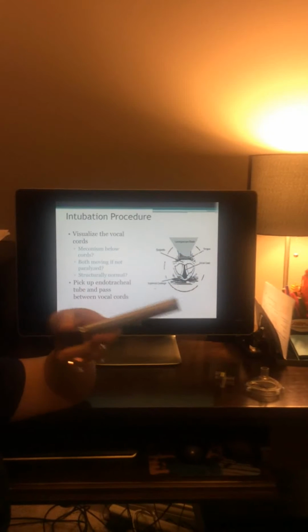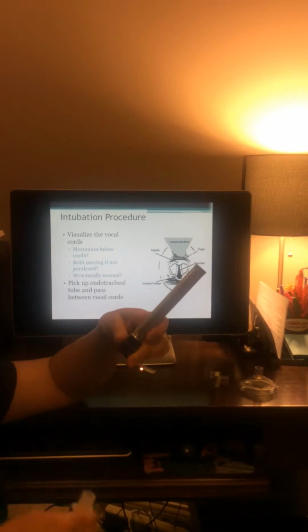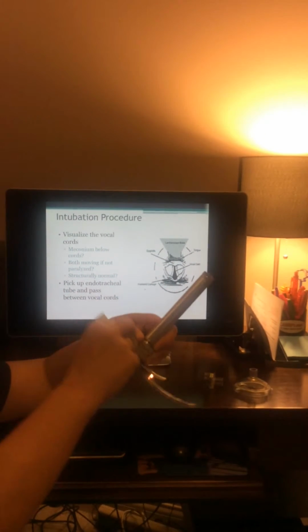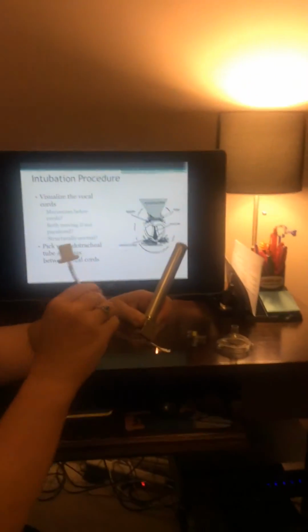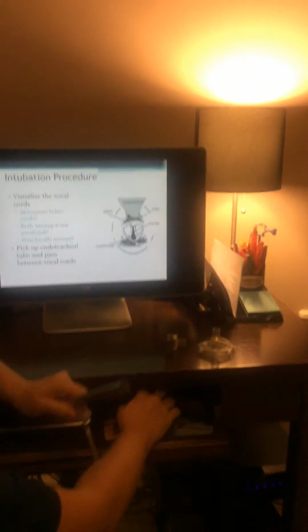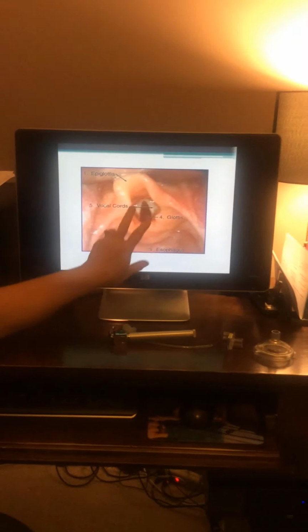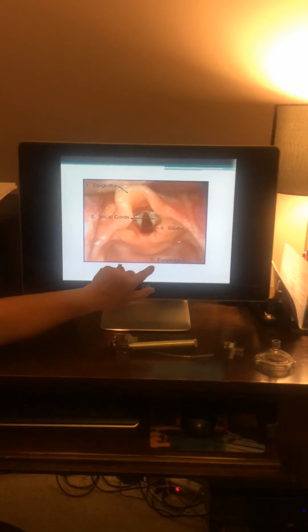One of the things that I was taught, once you get in there, there's not much mouth to work in, like you would have for an adult. And you don't want to use the tube as your guide, because then you can't honestly say that you saw it go through the cords. If you give it just a little quarter turn here, you'll have a lot more mouth and lip area to play with, and then you'll be able to actually see it go through the cords. So this is actually what you're looking for. There's your epiglottis, there's your cords, the glottis, and then here's the esophagus. Again, if you see this, you need to pull back, you're too deep.